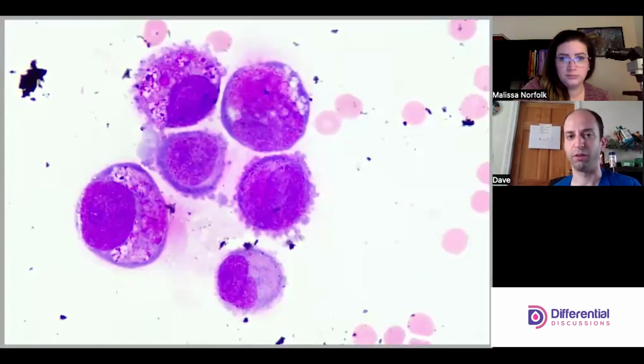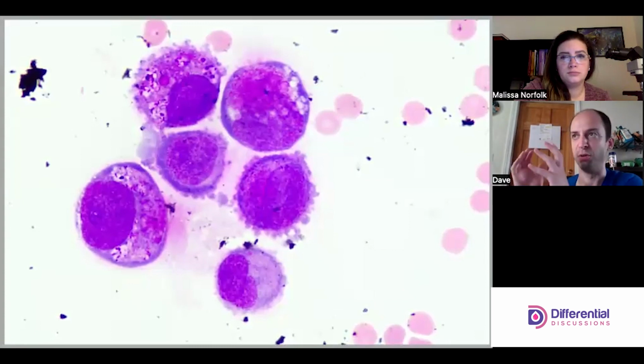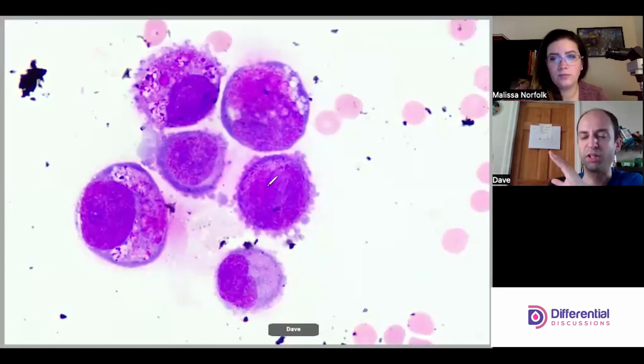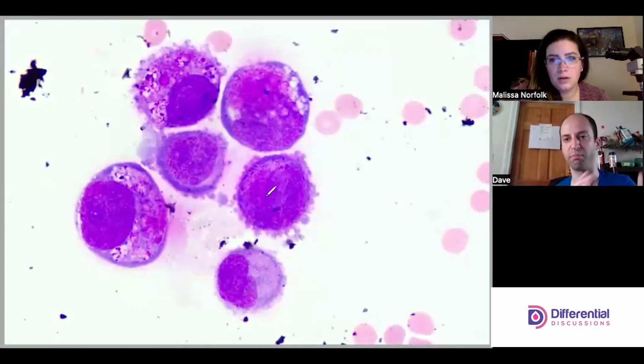So this is a bit troubling. I'm inclined for pretty much every cell here to just put them into an other category, and then get more specific when I get a better handle on what's going on. The normal-ish looking one is maybe this guy, but the fact that it has this lumpy bumpy exterior, I'm just going to be safe and put it in the other category.